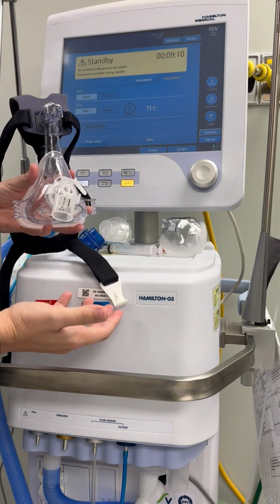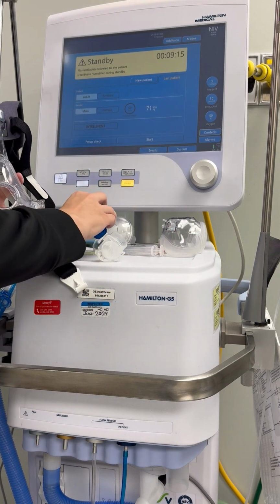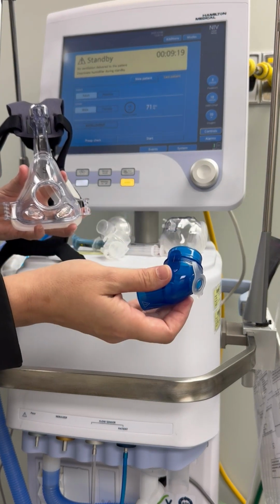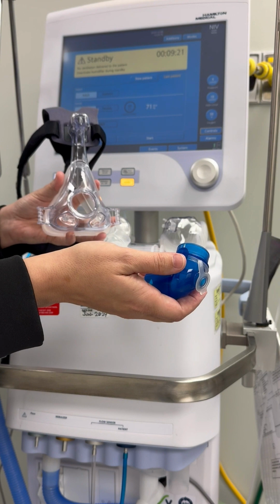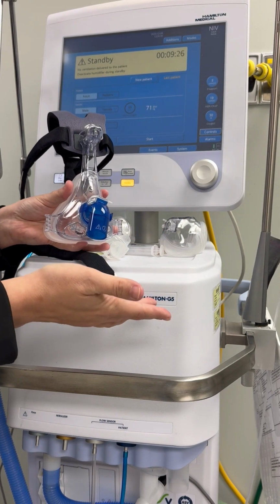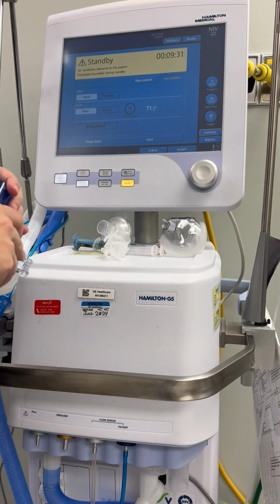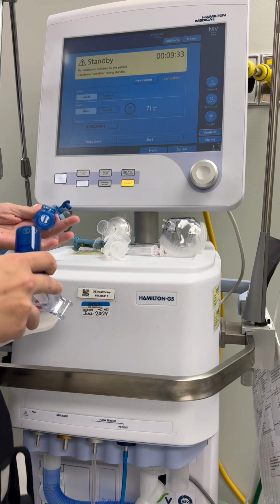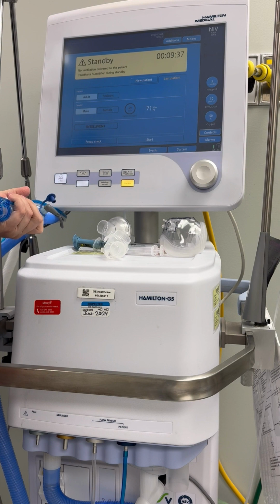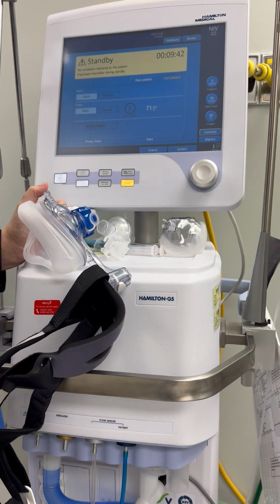So we will remove the elbow by just pinching it and pulling. You will then grab the blue elbow that we keep in our equipment area, and you will attach the elbow to the front end of the mask by just clicking it in place. So now your mask is ready to be set up on the Hamilton vent. So you will connect the mask directly to the circuit right on the flow sensor. And now it is ready to be placed on the patient.